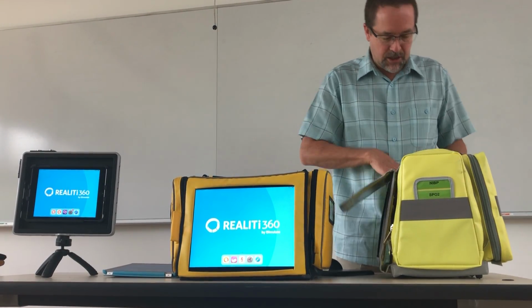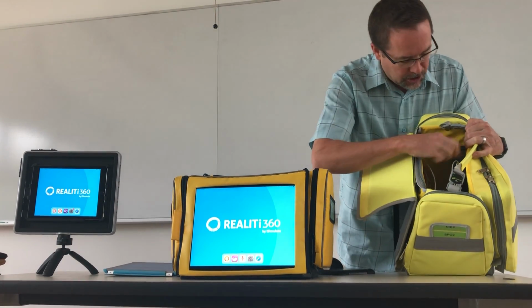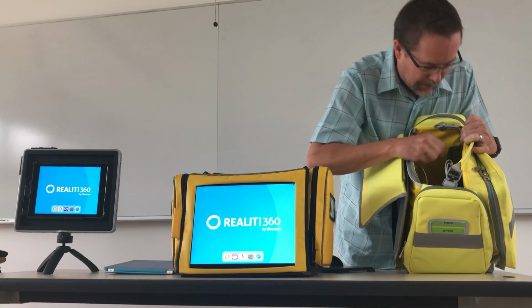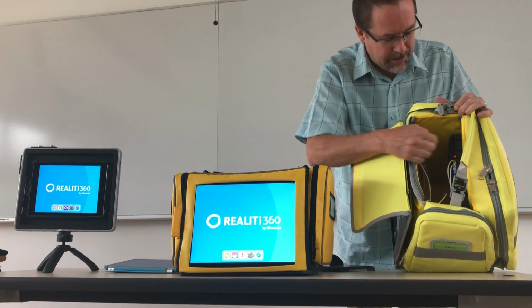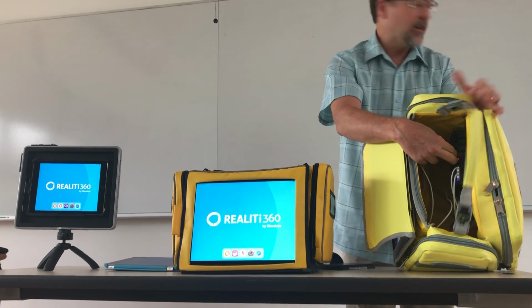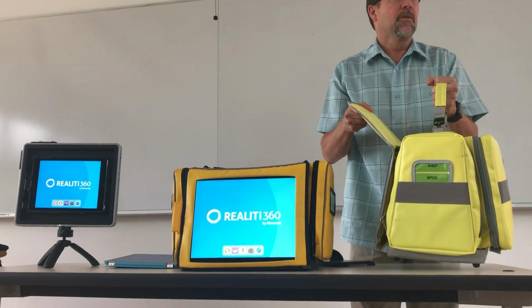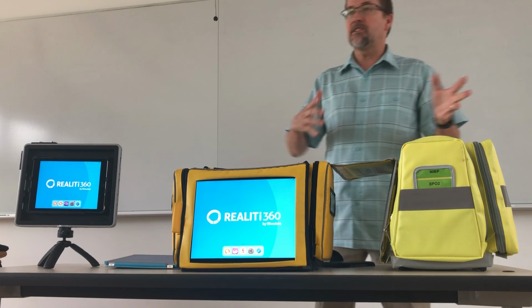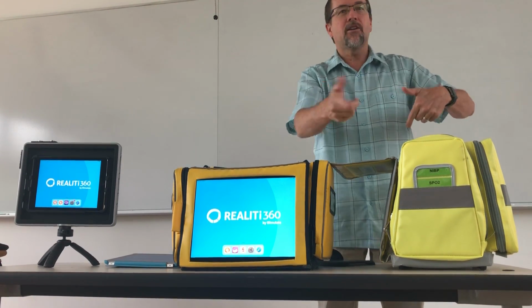One of the things they do in the bigger version is inside the bag is a battery pack. With this particular battery pack, which is turned off right now, if I turn it on, it has these 2 little USB ports, which can power the iPads if you want. The main thing is it's got a little switch that you turn on. When the light comes on, now it's powering the outlet. So I can plug the router into that, and now the entire thing is mobile. That's really nice if you're going to be moving around. We'll do a lot of scenarios where we start outside and then move to the ambulance and then move somewhere else and do a handoff report.